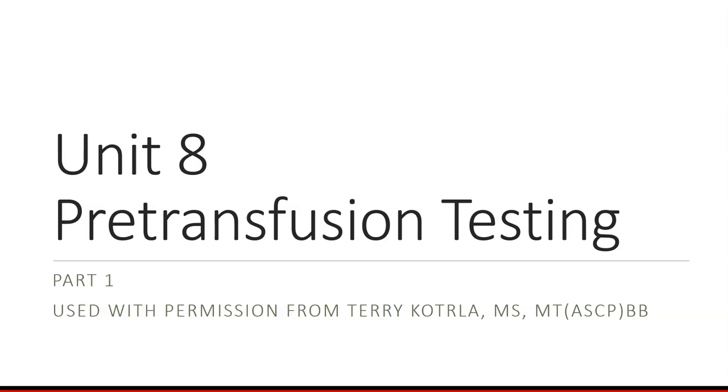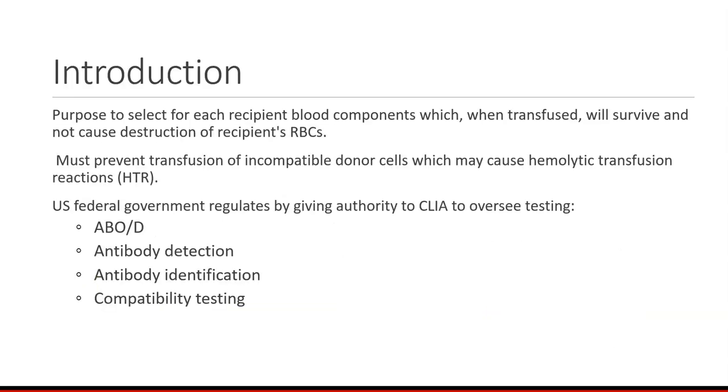In Unit 8, we will discuss pre-transfusion testing, and I apologize for my voice. I have some kind of upper respiratory bug, but this is part 1 of 3. The purpose of pre-transfusion testing is to select for each recipient blood components which, when transfused, will survive and not cause destruction of the recipient's red cells.